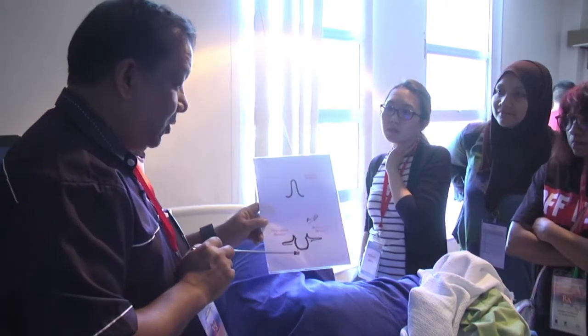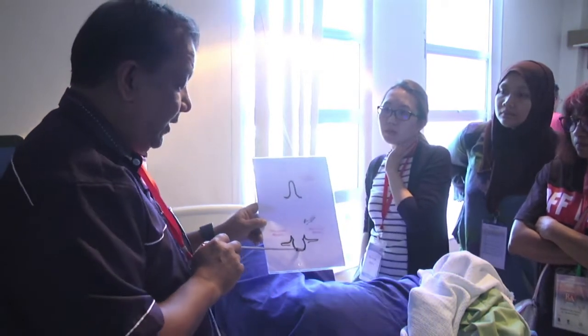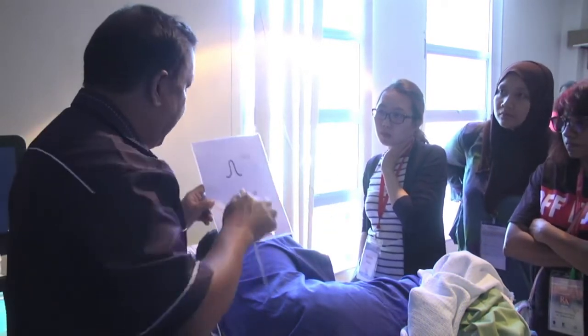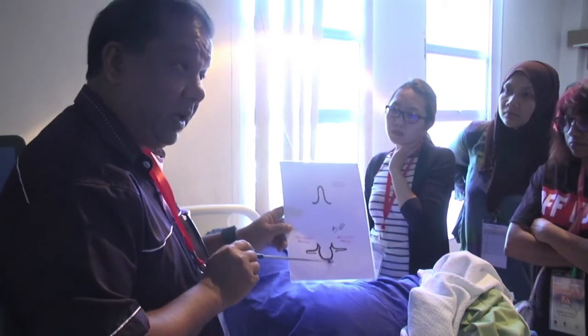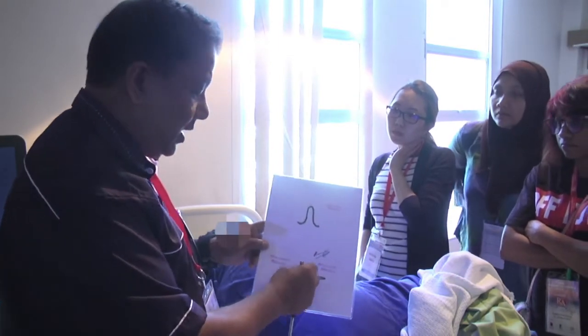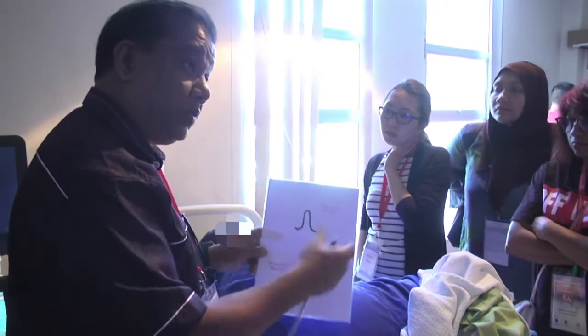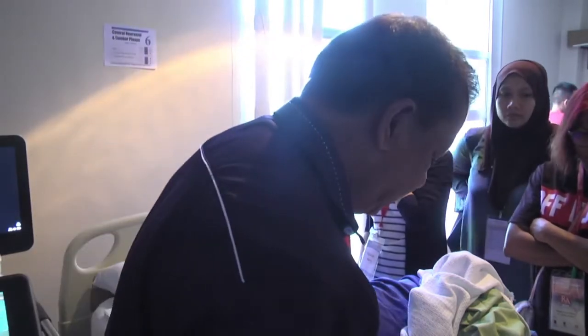Right? And it's very difficult to define what these structures are. And they're often a composite hyperechogenic echo. So if you can see this as a single echo, it's good enough because this becomes your anterior complex. Okay? So this is the anterior complex, whereas here will be the posterior complex, which is more relevant for you. And I'll show you the relevance of this.